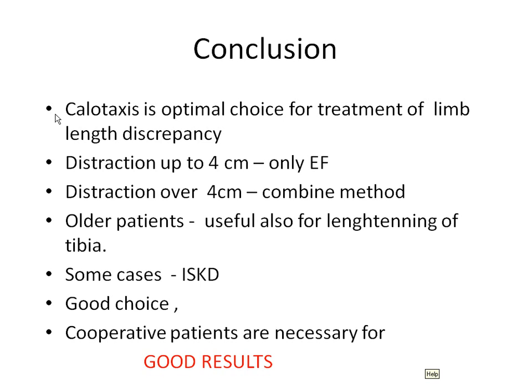We have some special patients after trauma of the long bone who have a locked nail and are healed with shortening. We have 4 patients in this treatment, which I think is quite nice. We unlock the nail, put on the external fixation, make osteotomy, distract to the desired length, and then lock again. So patients are satisfied that they don't need any other surgery. It's necessary for a good result: a good choice, and a very cooperative patient.